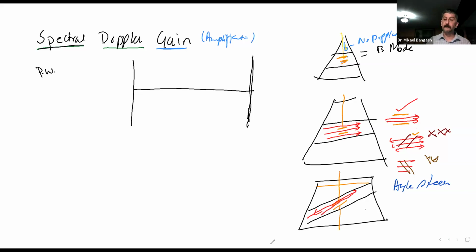Did you guys get that? Yep. Good. Okay. So once you have ensured this, and you still don't see any Doppler shift on your spectral Doppler, clear? Okay. Which mainly means that you just see the spectrum. Now, please keep in mind, guys, whatever is white here is going to be black on your spectrum, or whatever is going to be black is white.